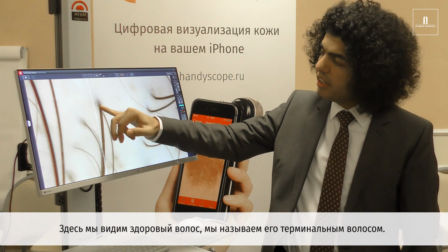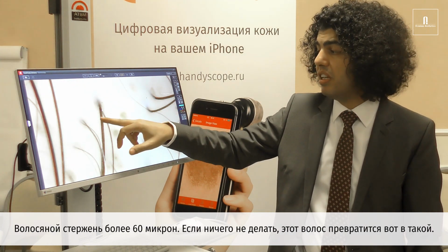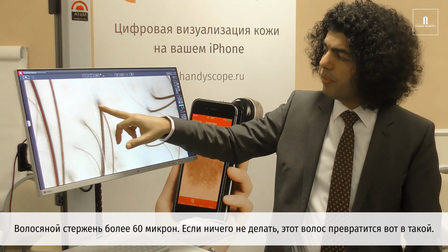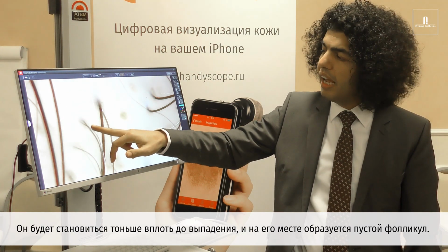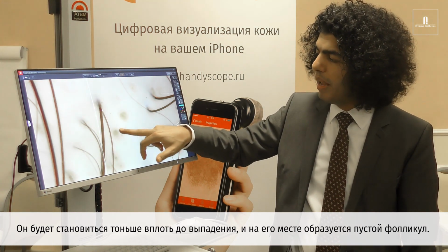In this case, we see this is a healthy hair, so we call it a terminal hair. The hair shaft is definitely above 60 micron. This hair, if you don't do anything, turns to this. That means it becomes thinner, vellus. And then it becomes even thinner until it is lost and you have an empty follicle.